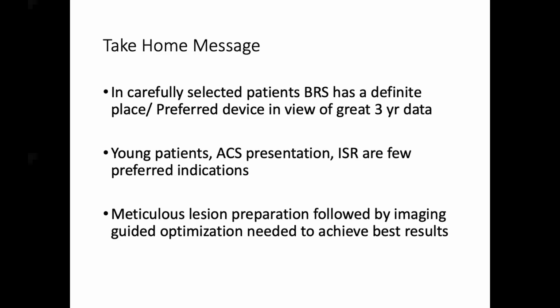We need OCT imaging, or any imaging. If OCT is not available, we can use IVUS also. So image-guided optimization is needed to achieve the best results.